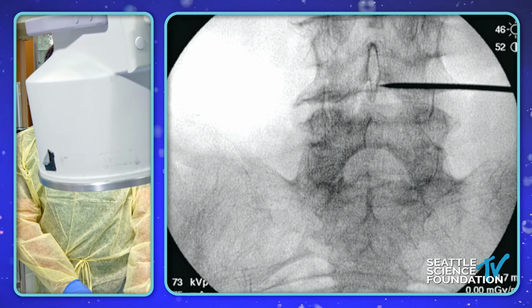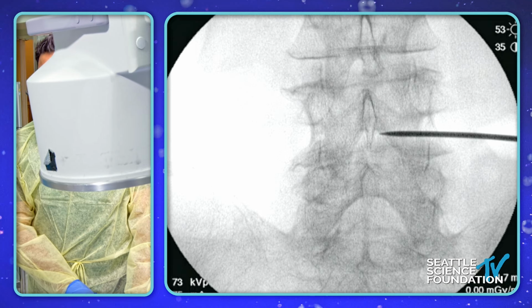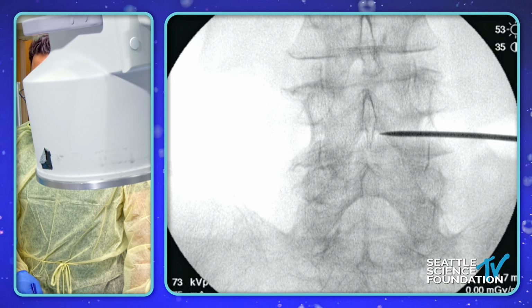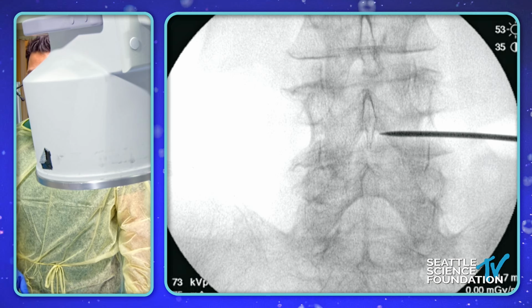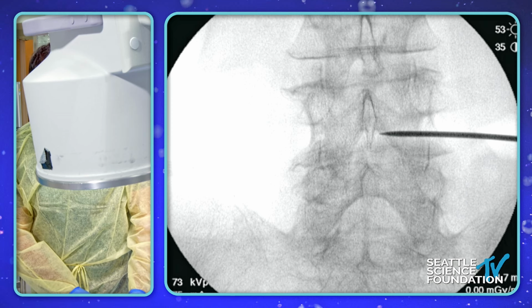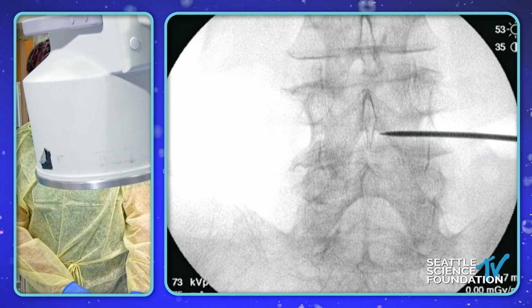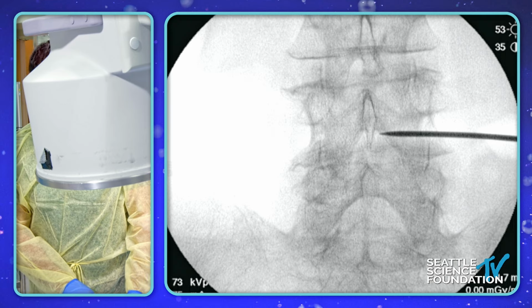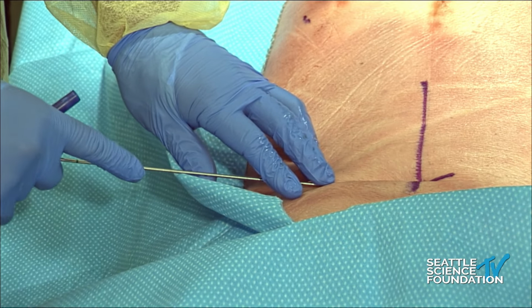Just to clarify, Saqib, you're using 4.5 because we're going into tissue handling and bone drilling after, so you want to optimize that to make sure they have enough bone to drill on the next steps, right? Exactly. It's important to clarify that if you're going to do your first interlaminar, it's probably going to be L5S1 where that huge window is in the bottom, but you're purposefully going up here for your interlaminar demonstration. Yes, we're all trying to work together. So if I target here, then they can use this area later for their bony decompression. So 4.5 is a lot of bone, a smaller window than 5.1, like you said. We're going to start here at 4.5, and hopefully the other guys are going to be able to do a nice decompression. So take a shot there.